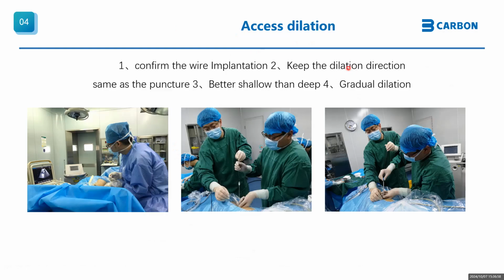And the access dilation, for the safety, there are also some rules for the dilation. First, before the dilation, we should confirm the wire implantation, just that the wire is inside the calyx or not. You have to make sure.